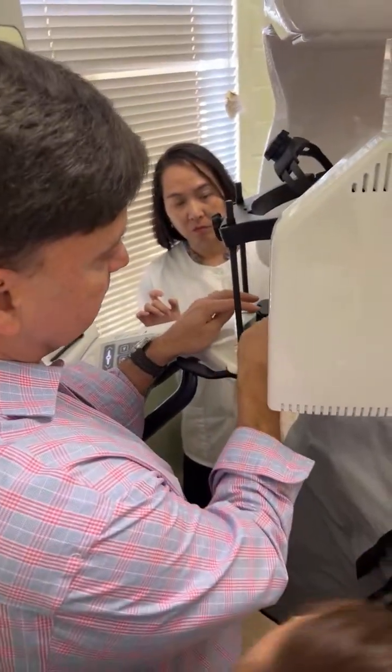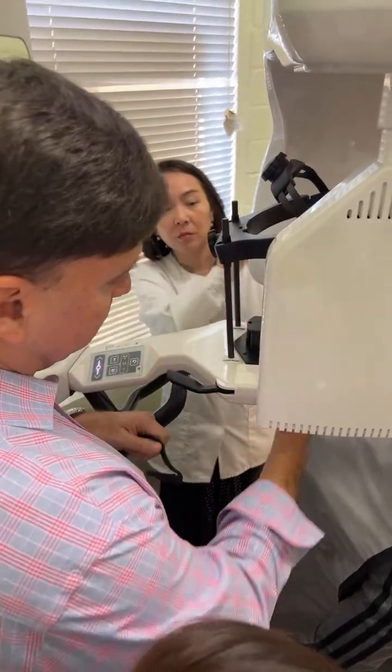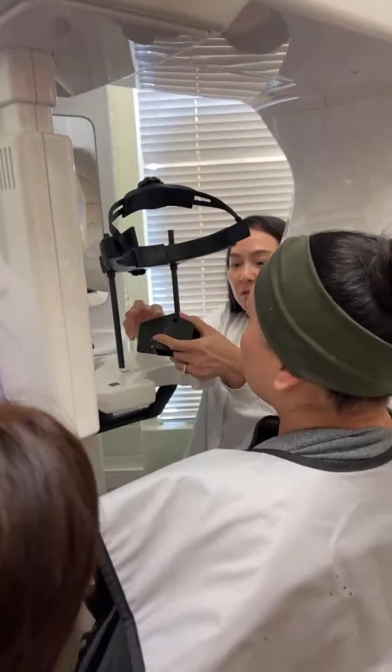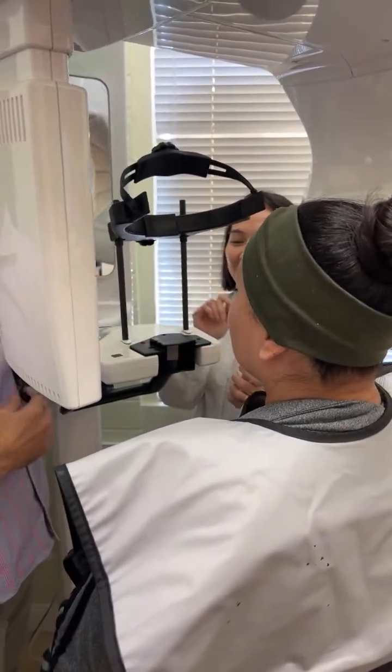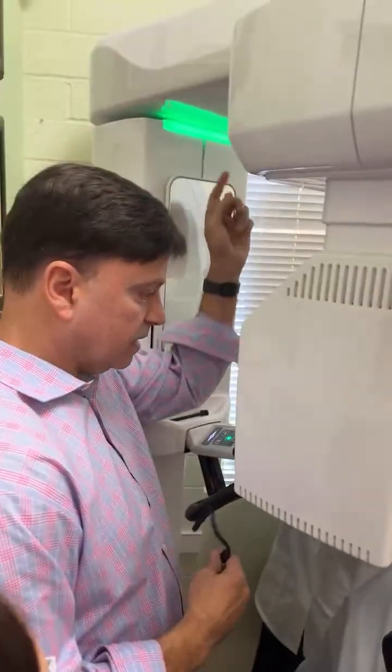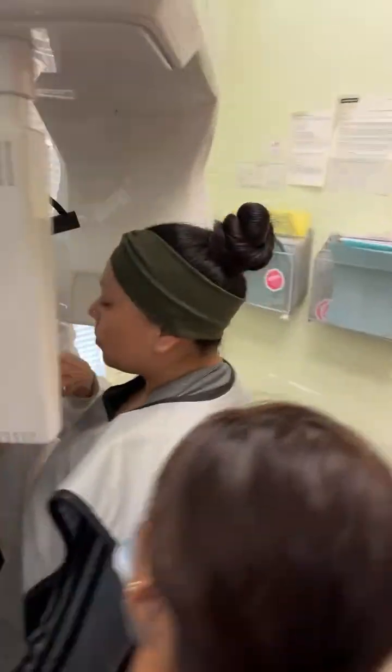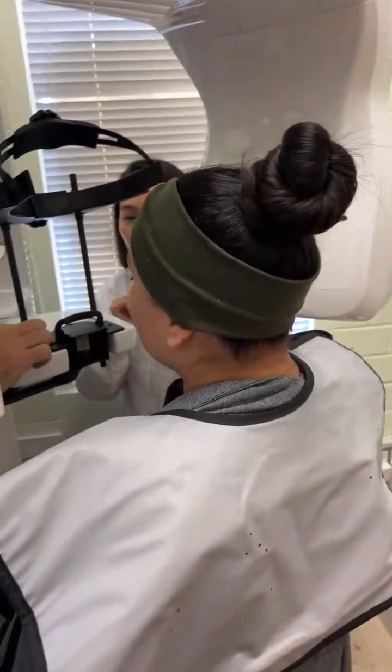So we're in the maxilla, right? So please turn that over. Flip it. Yep, it won't work if you don't. Now it's happy, see? It's green, good to go. So when we put it right here, you can't put it here, so this is the only place to put it. I don't know why these grooves are even here, but you can only put them there.